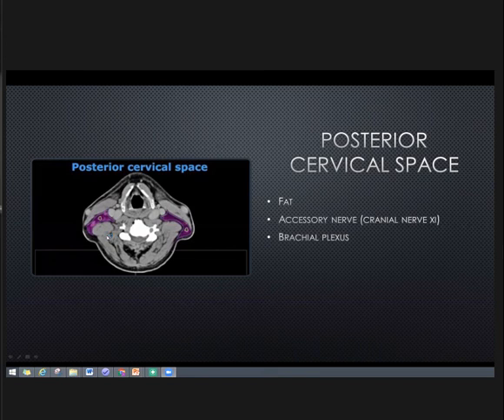In the posterior cervical space, look for metastatic lymph node disease. In the visceral space, look for primary malignancy, particularly in the larynx and hypopharynx. Okay? No questions? Okay. Noel and Sam? Actually, it's good to read head and neck, because you just look for the space.